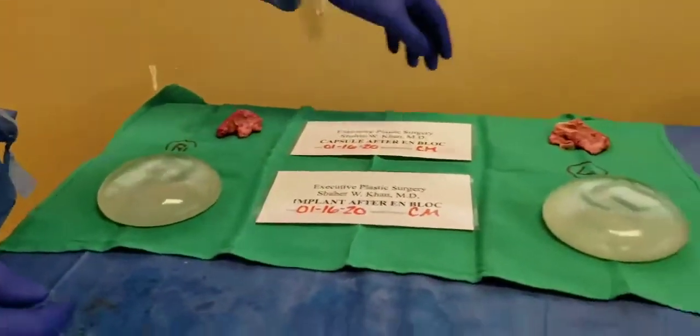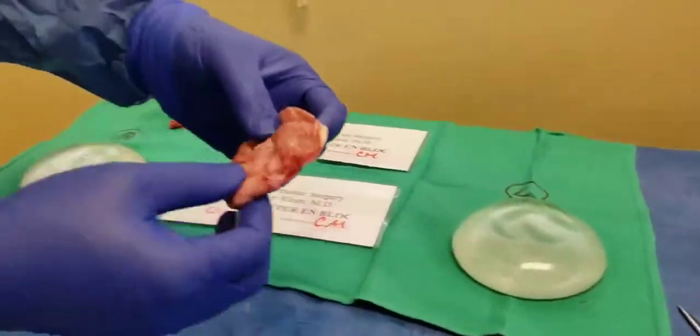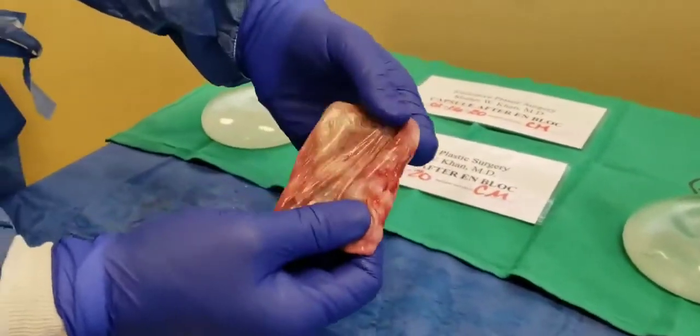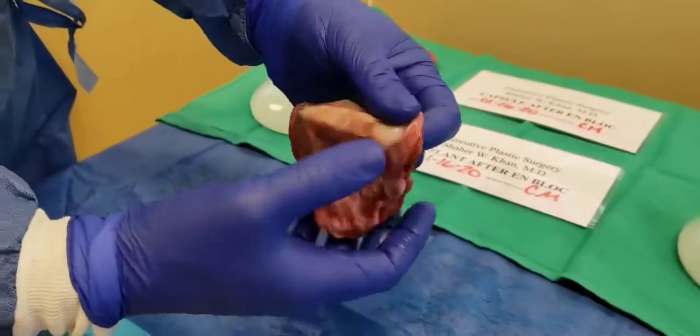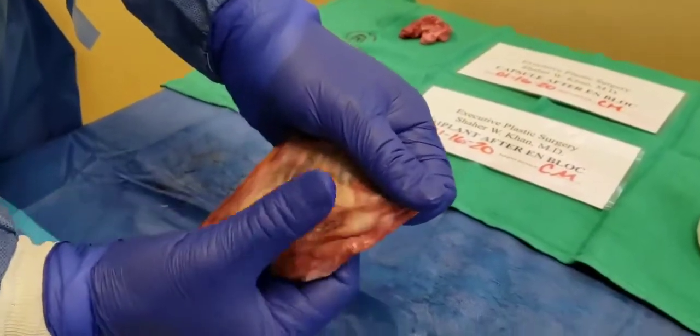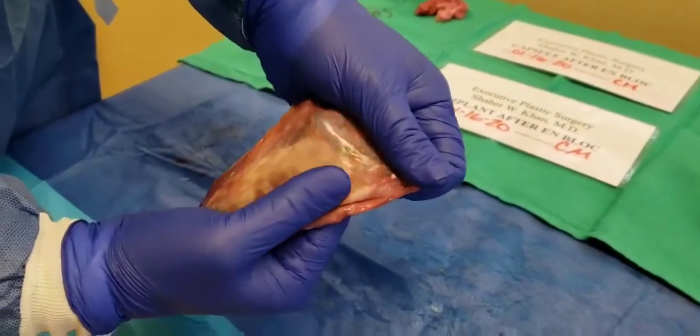Now I resected in a similar fashion. These capsules are going to be going back to the pathologist. And look, if you feel the areas of thickness and relative thinness.